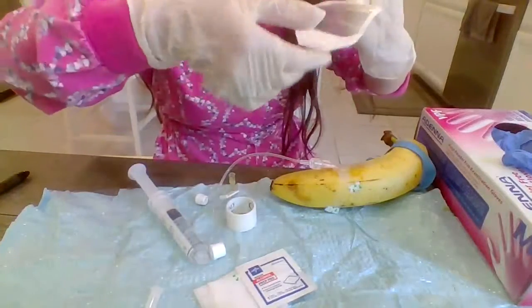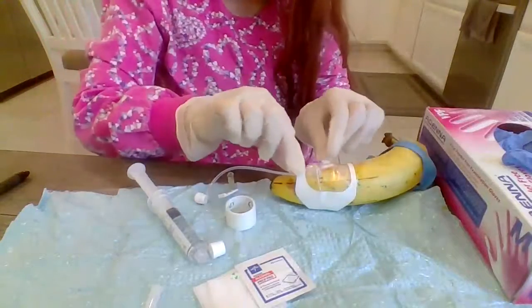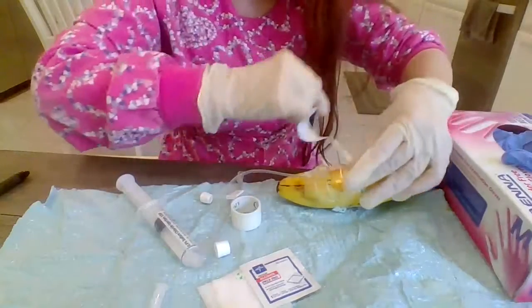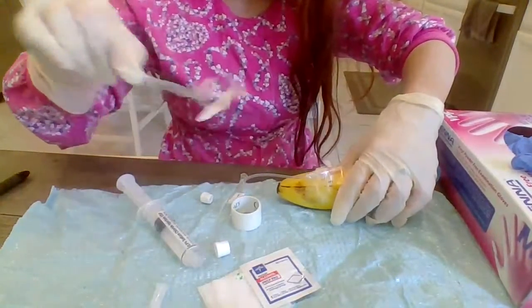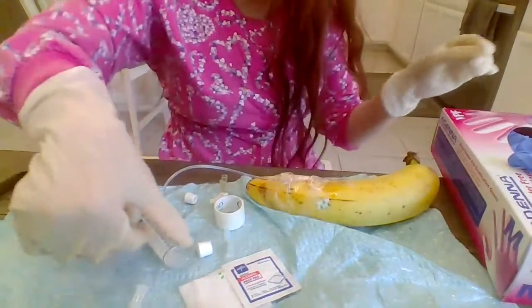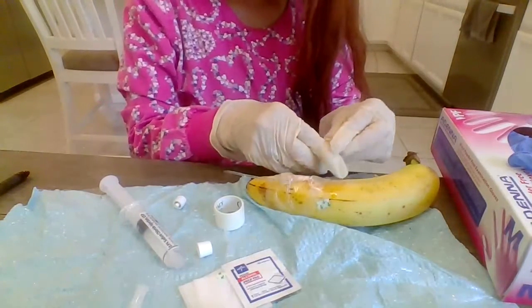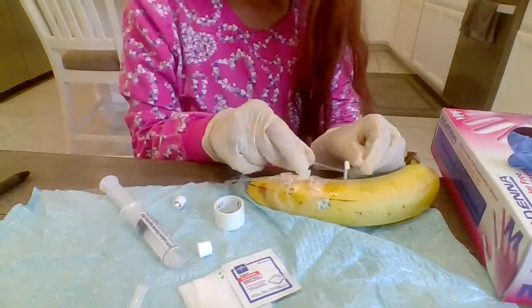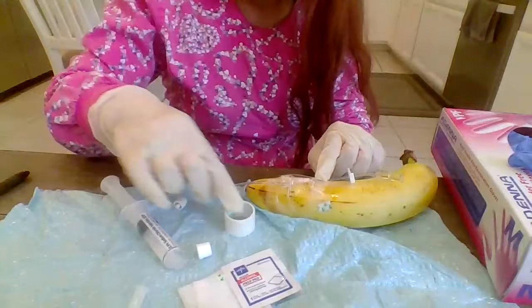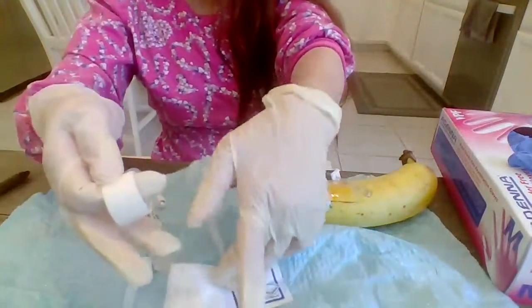Oops, the other way. Now I'm going to go ahead and secure the extension with another tape.